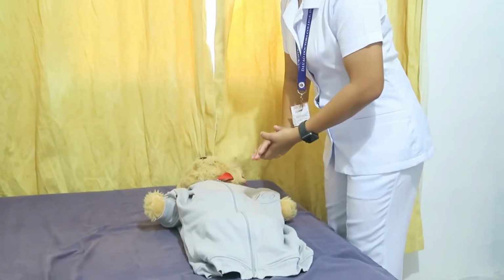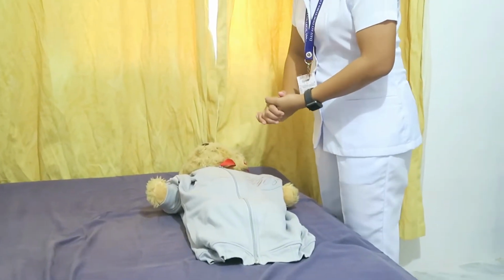perfusion. Next, the compressions should be at a depth of at least 2 inches or 5 centimeters. This is to increase the venous return and also for the heart to be able to pump blood effectively. Lastly, let the chest completely recoil after each compression. So the patient has no pulse and no breathing. I will now start giving the CPR.